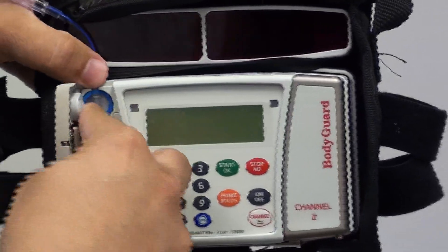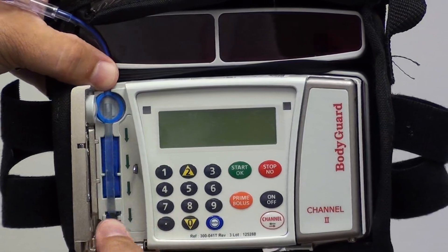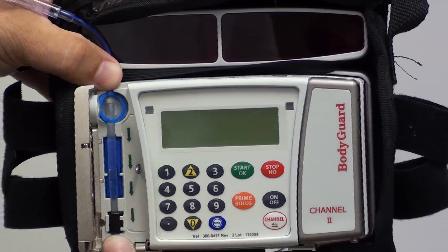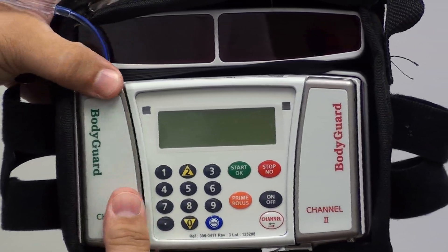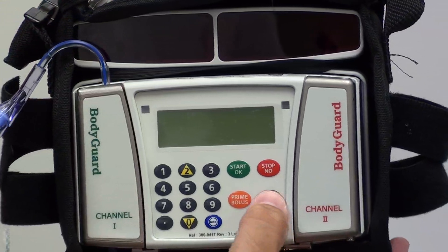We start with the blue ring — press it through. The key will be on the outside and push back towards the middle. Then close the door, close it snug, and press the on button.